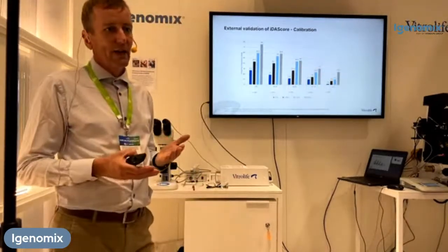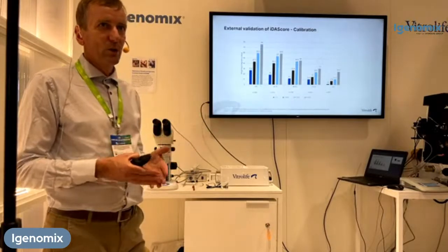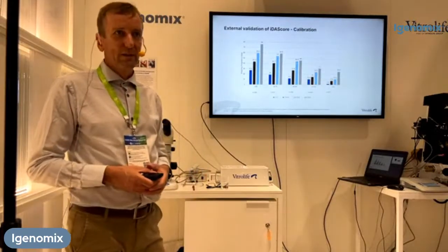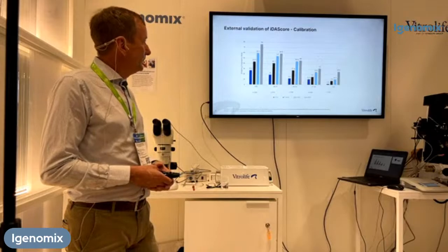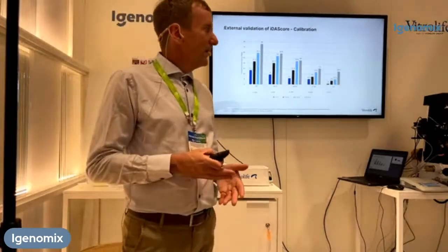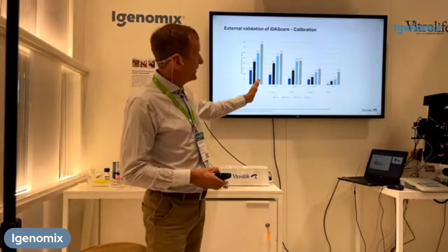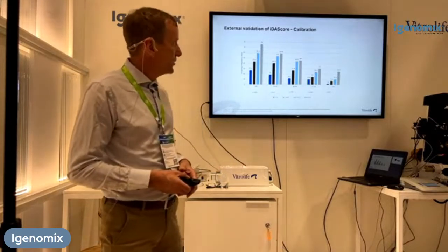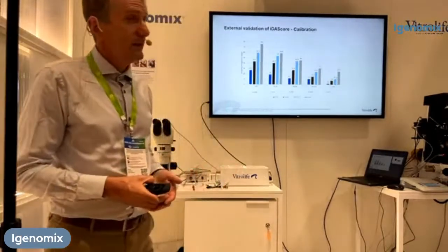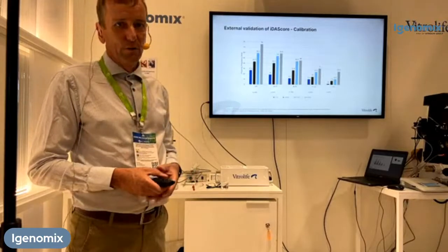And this is then an example from the same article on what we call model calibration. This is where you group your embryos according to the scores and see how the actual rate of ongoing pregnancies is. And as shown here, you get a very strong correlation between the scores and the actual rate, and that is true for all the 5 different age groups. So again, this shows that we have a model that is very good at predicting the likelihood of implantation.